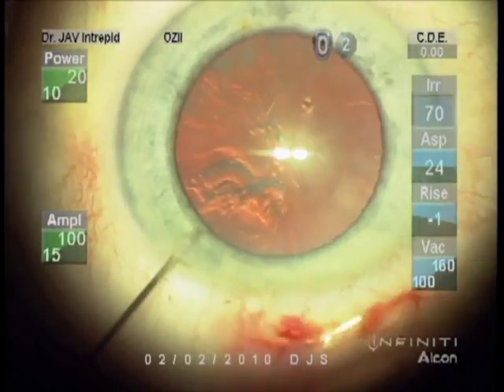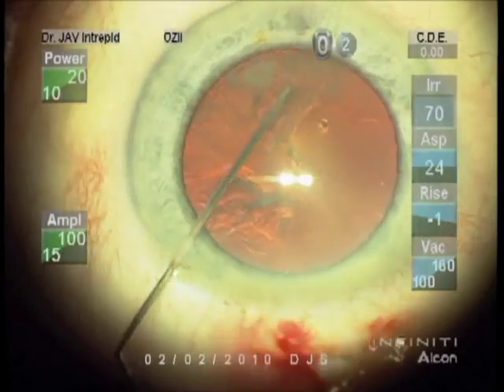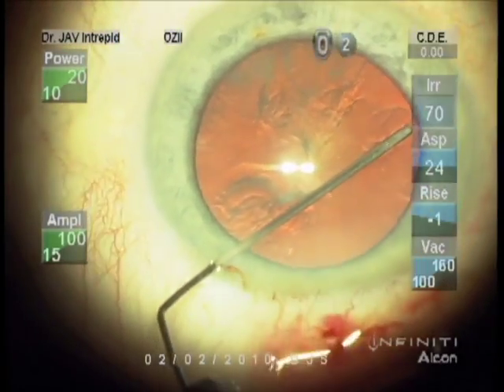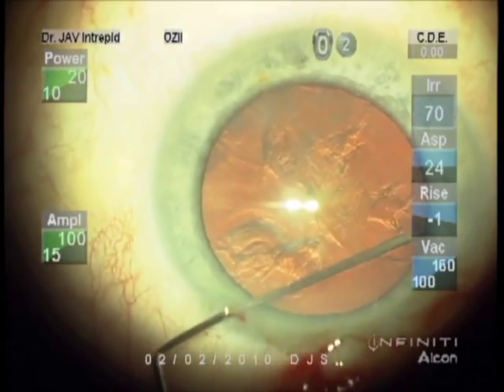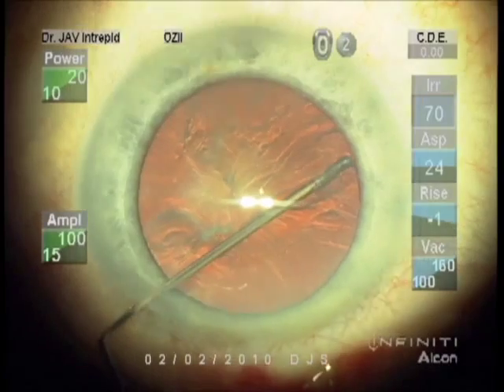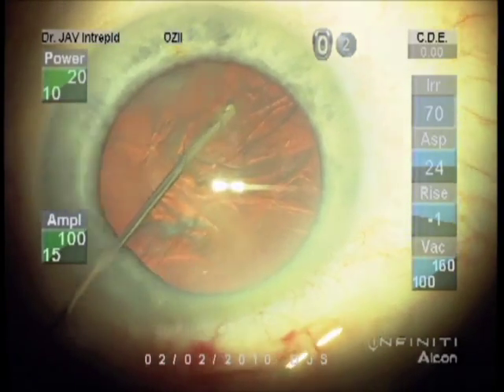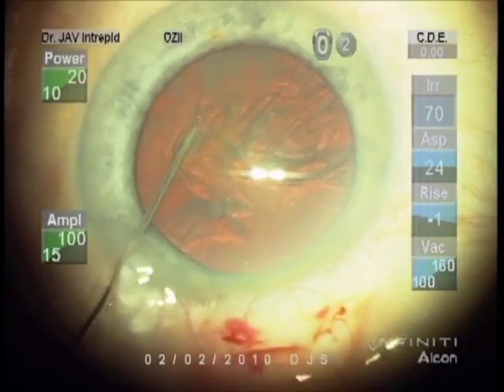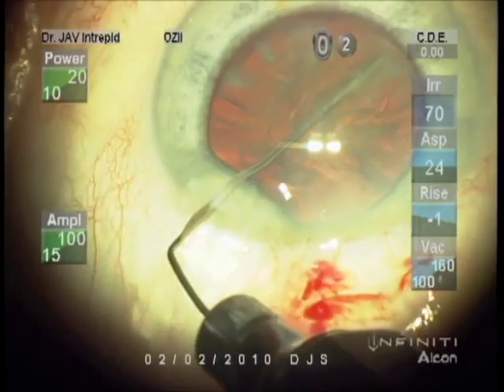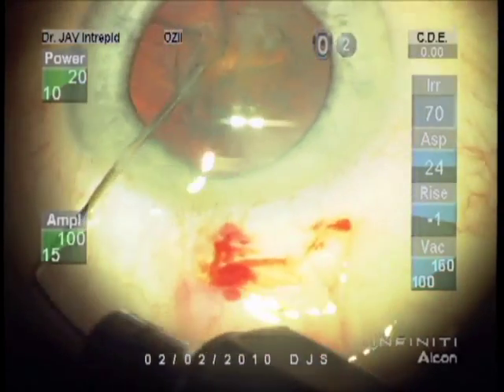30 gauge from the side, about four different points — just irrigate immediately under the capsule. Going to the twelve o'clock position, pressing down slightly to get the fluid to flow forward, and taking advantage of that twelve o'clock position. Do a little retro rotation, then a forward rotation, rotating freely.